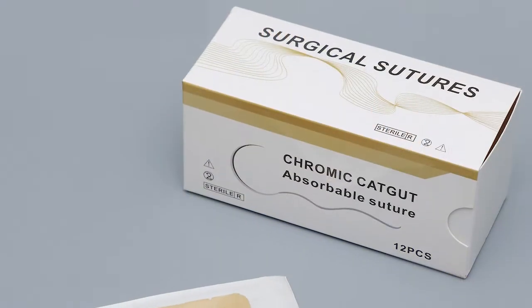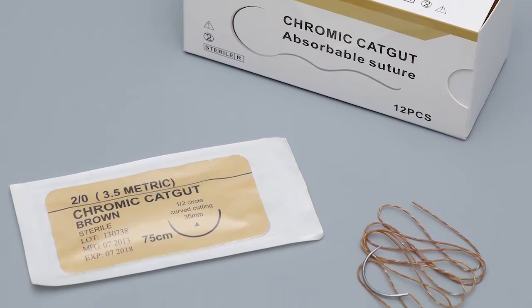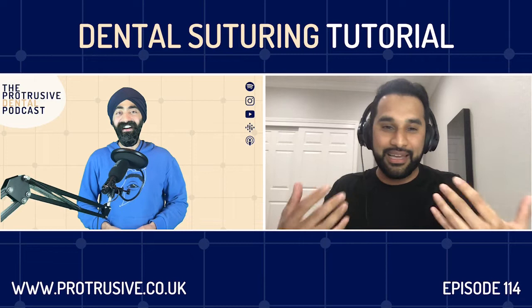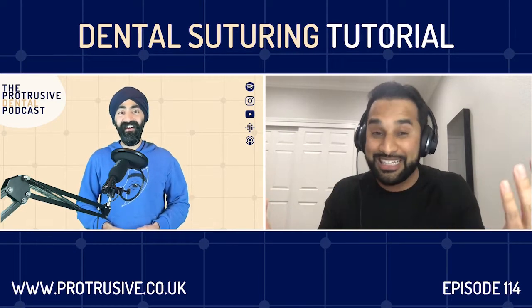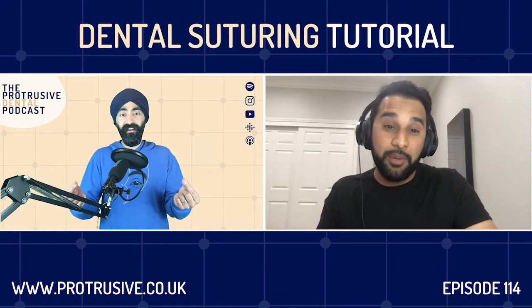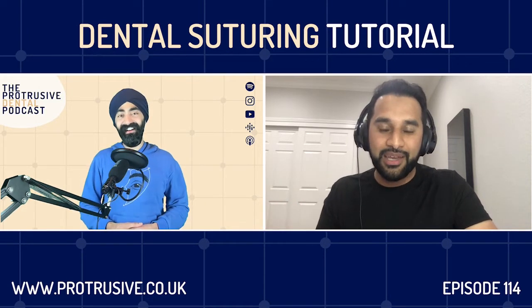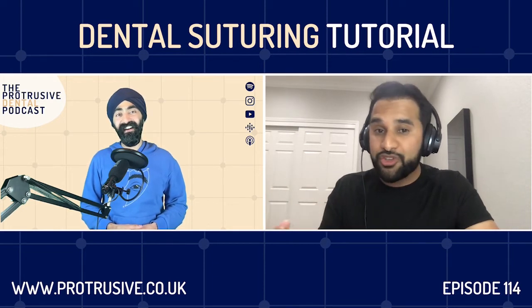Yeah, what is up with that name? Chromic gut, it just sounds horrible. What does that name derive from? It's the gut being like the cat gut intestines, and the chromic formulation to make it last longer. So it's actually made from the intestines of a cat. Maybe originally, but I think now there might be a little bit more synthetic material used in them. But those materials are more natural materials.